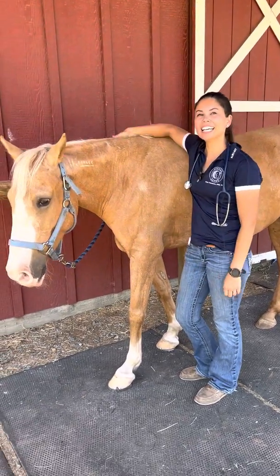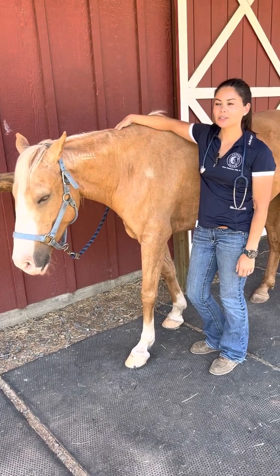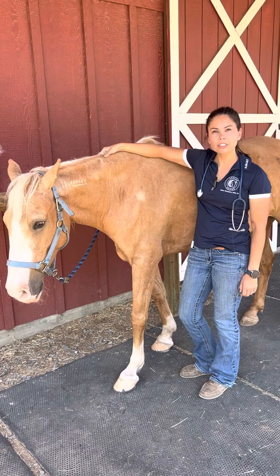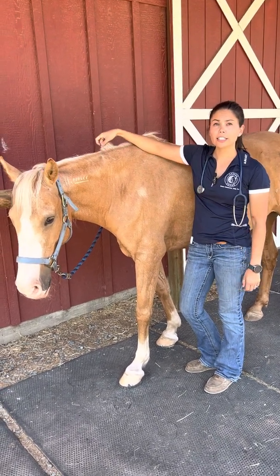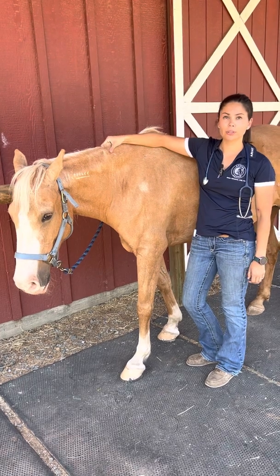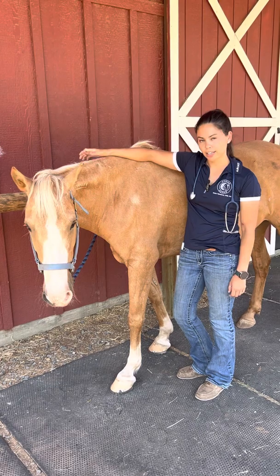Hi there, I'm Dr. Brianna, and today I'm going to tell you a little bit about taking vital signs from your horse. Times you would do this are if you think your horse is colicking or in pain, or you're calling us out for an emergency. It's always a good idea to get a heart rate, some gut sounds, and a temperature on your horse, and that way we can better understand what's going on and better advise you of what to do next.